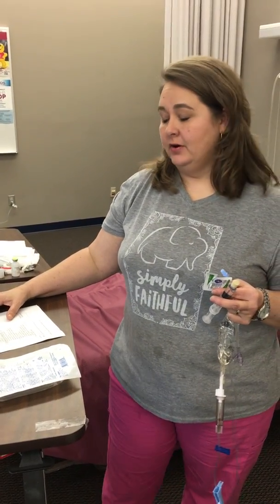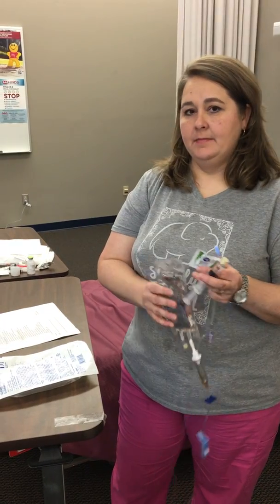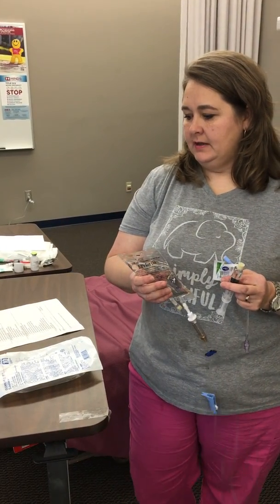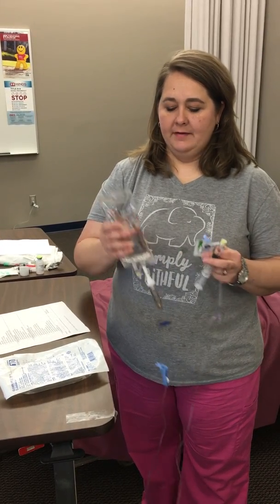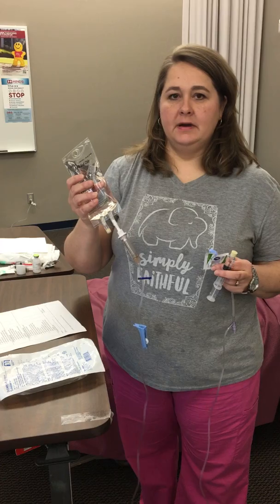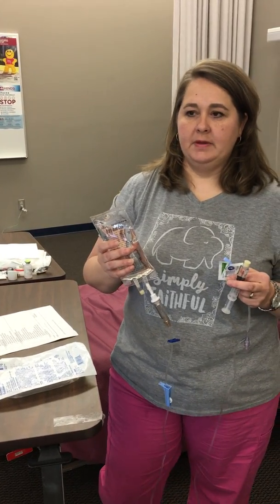I have another IV skill to demonstrate for you. This is an IV piggyback medication that we're going to calculate and administer at the correct rate through an INT that's already existing. I have already pre-primed my IV tubing, and remember that we've already checked and we have the correct medication.